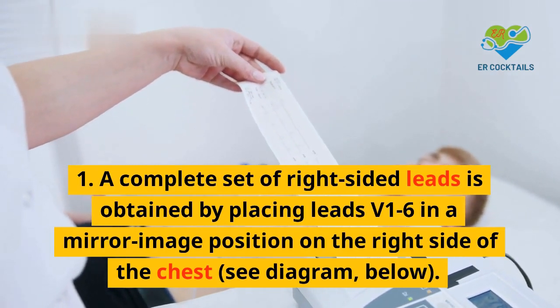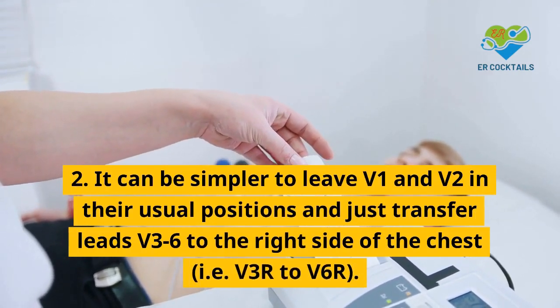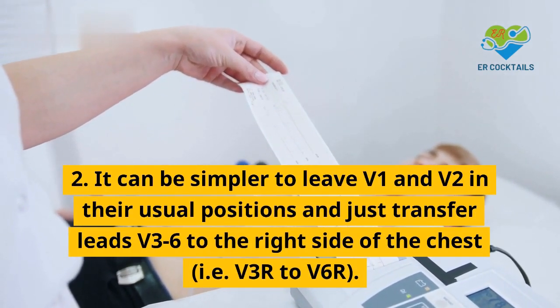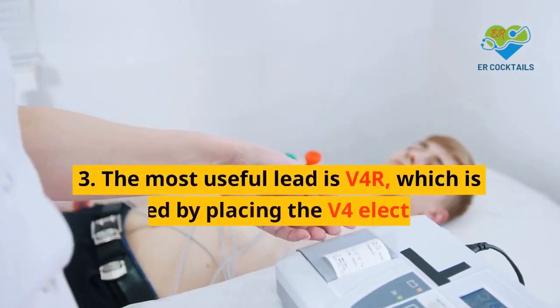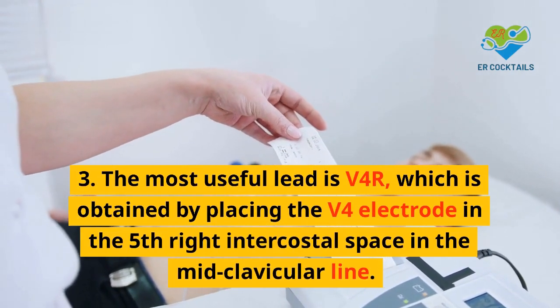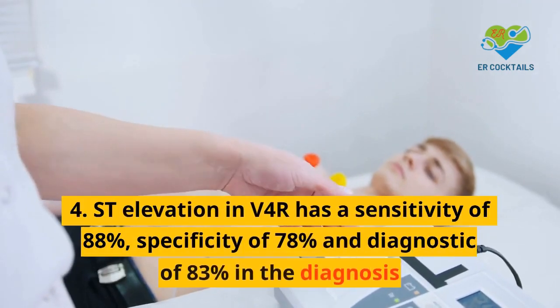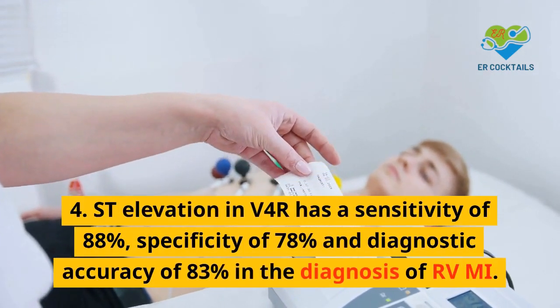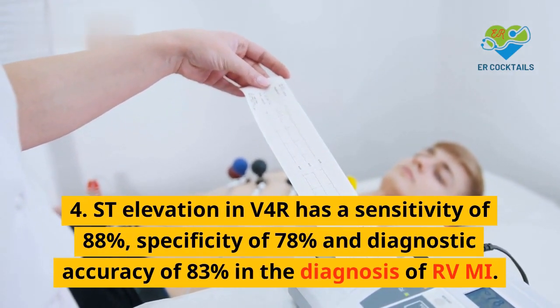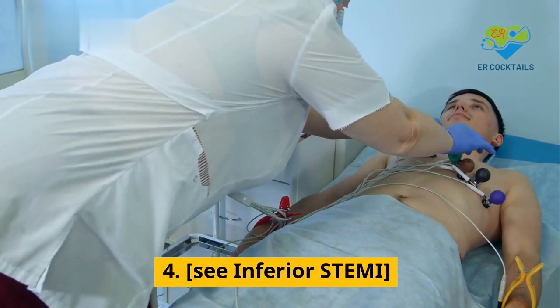See diagram below. 2. It can be simpler to leave V1 and V2 in their usual positions and just transfer leads V3 to V6 to the right side of the chest, i.e. V3R to V6R. 3. The most useful lead is V4R, which is obtained by placing the V4 electrode in the 5th right intercostal space in the mid-clavicular line. 4. ST elevation in V4R has a sensitivity of 88%, specificity of 78% and diagnostic accuracy of 83% in the diagnosis of RVMI. See inferior STEMI.